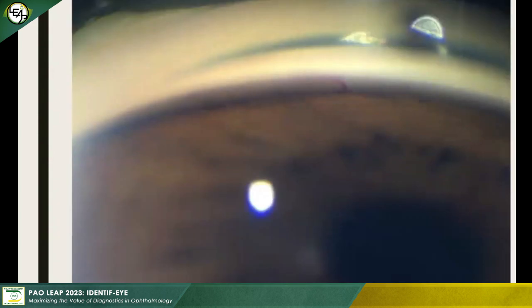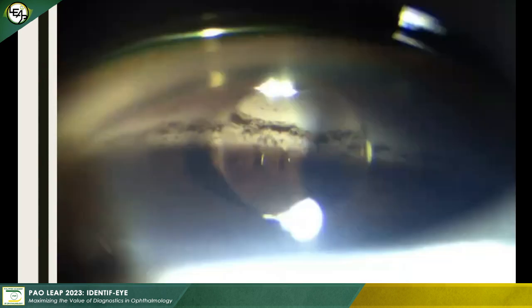Sometimes the artery can be visible on your angles. So the artery encroaches on the root of the iris sometimes and its juncture with the ciliary body band. Characteristically, only short segments of the artery come into gonioscopic view in this way. And these always have an obviously circumferential direction. So notice how it goes just a bit up, it curves and moves circumferentially and then dips back. Normal circumferential vessels on the ciliary body band never attach anterior to the scleral spur. So this is just a normal variation.